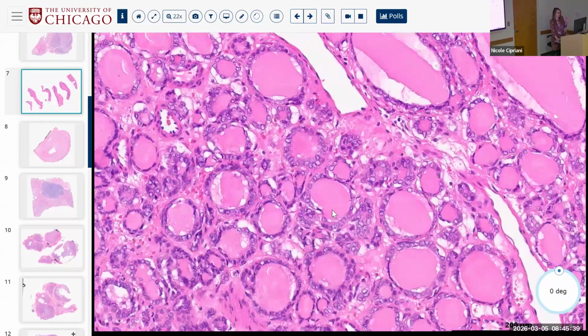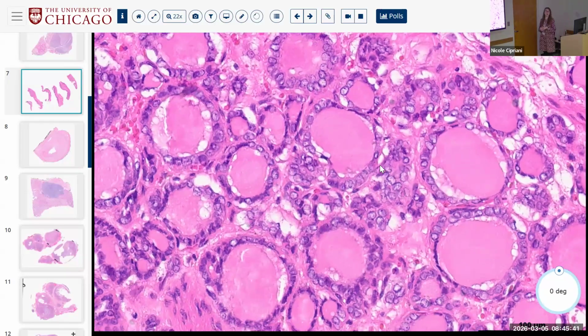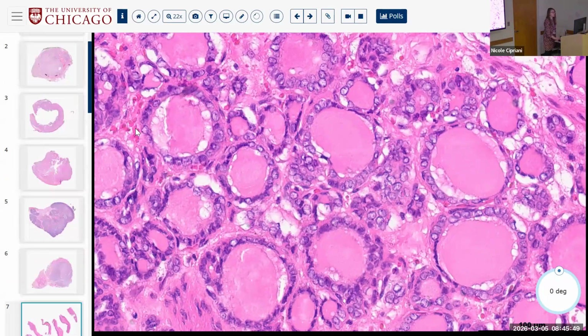And you have to be very, very careful, right, about looking at all of these nuclear features. And the minute, even if on the other cases, right, you were worried, throw on the BRAF IHC. It's not going to hurt anybody, right? In this case, definitely throw on the BRAF IHC if you don't have any other knowledge. This was sent to us in consultation, like for help with the diagnosis.